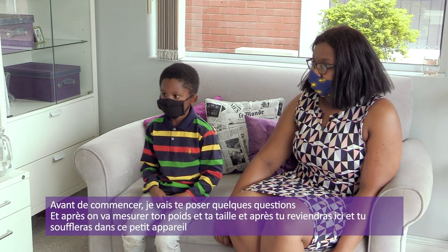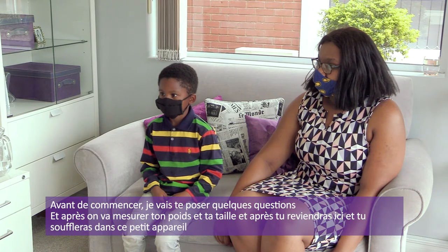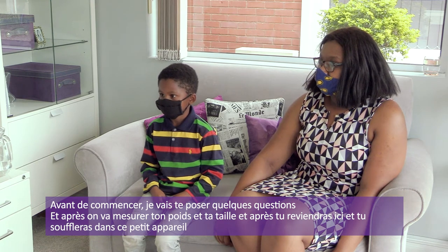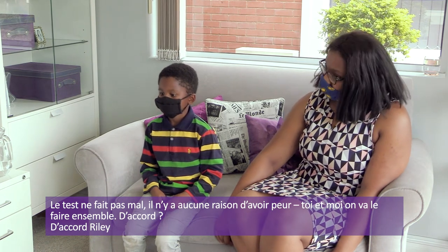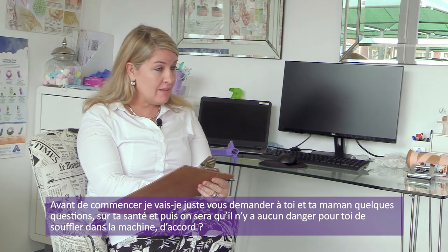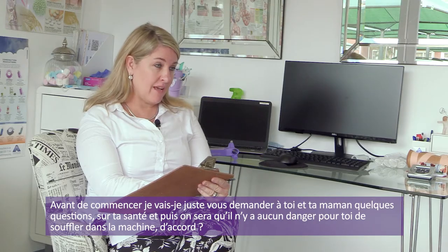All right. So before we start, I'm just going to take you through a few questions. And then after that, we're going to measure your weight and your height. And after that, we'll bring you closer and you'll be blowing into this little machine here. So the test doesn't hurt. There's nothing to be frightened of here. You and I are going to do it together. All right. Okay, Riley, so before we begin, I'm just going to ask you and your mom a few questions about your health, and then we'll know that it's safe for you to blow into the machine. Is that okay? All right, so how old are you, Riley?